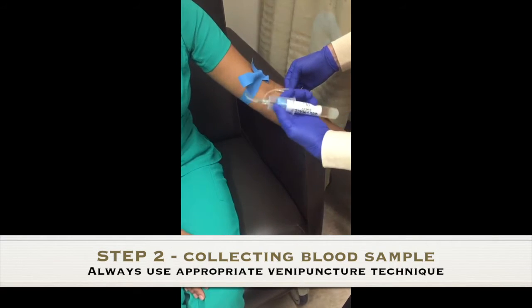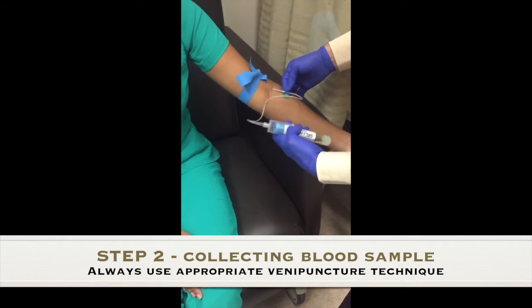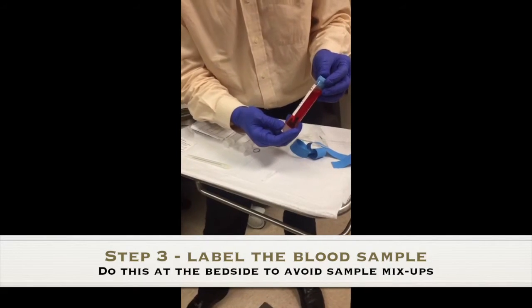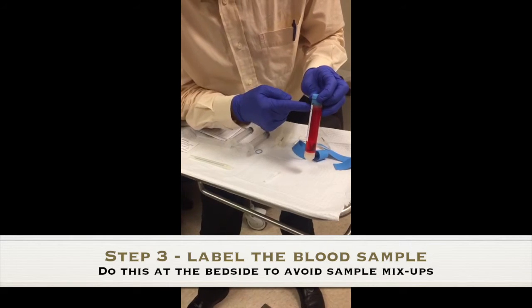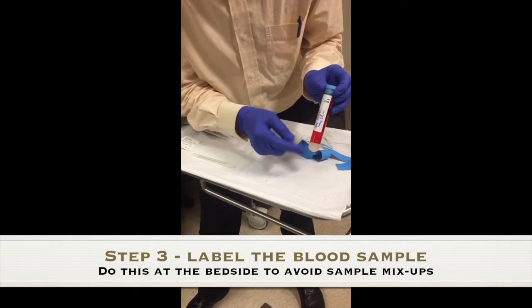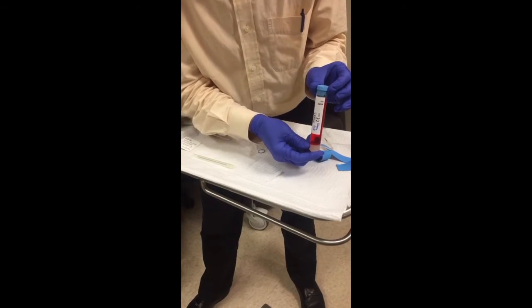I'm pretending to do venopuncture here. You pop it, the blood goes in, you take it out — that part's done. I just took 22mls of blood. This is food coloring for the video. You put the name and the date of the patient on the tube, and we're going to take it to the lab to spin.